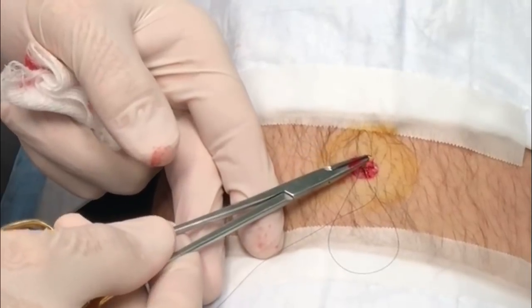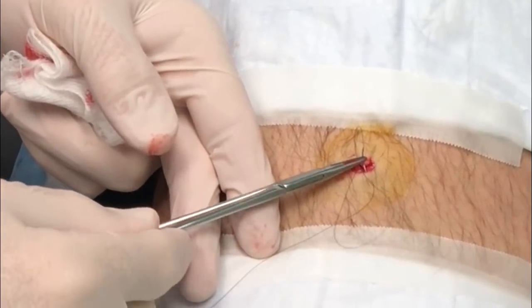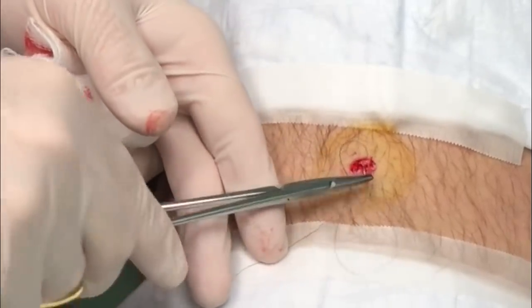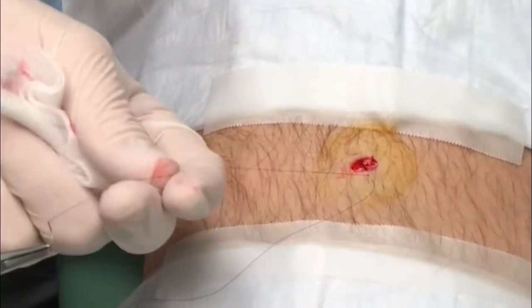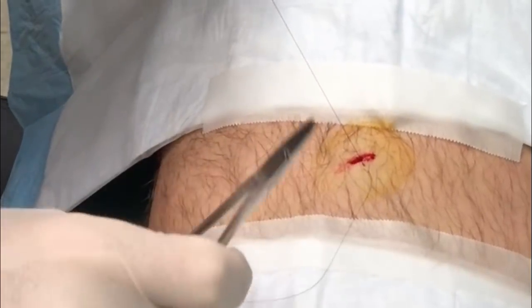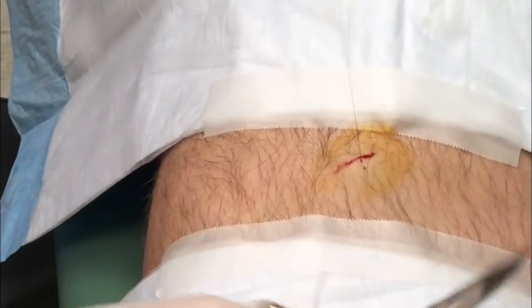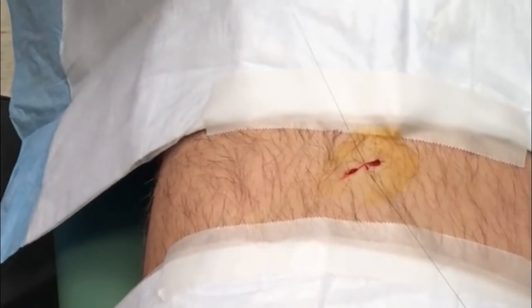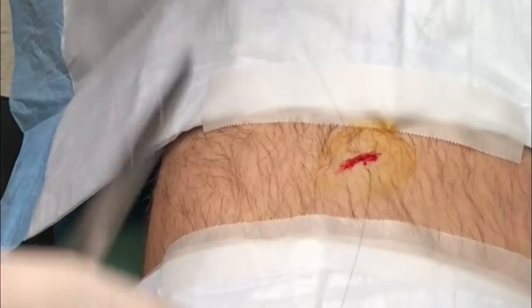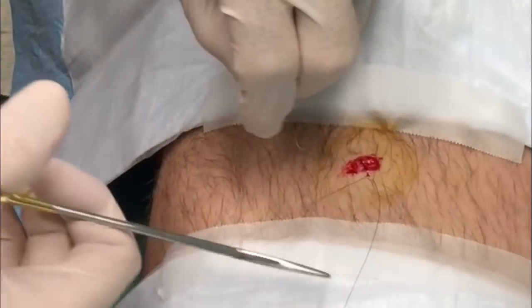This is a big punch biopsy piece — I'm actually doing a vertical mattress suture on this. You know, just because it needs to be reinforced just a bit. This is a vertical mattress, and they're sometimes hard to make them stick.